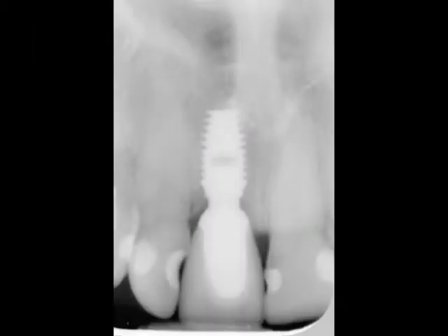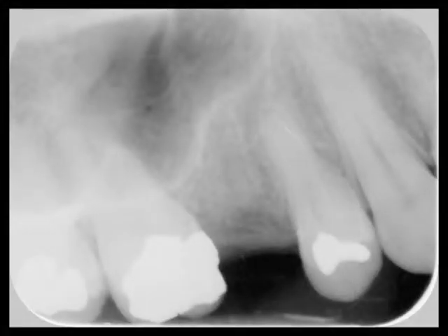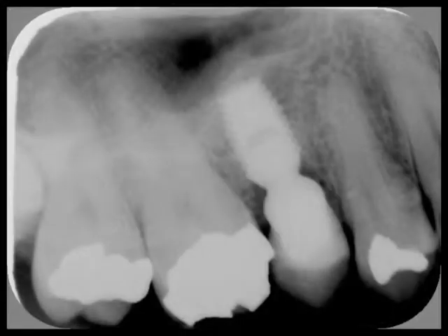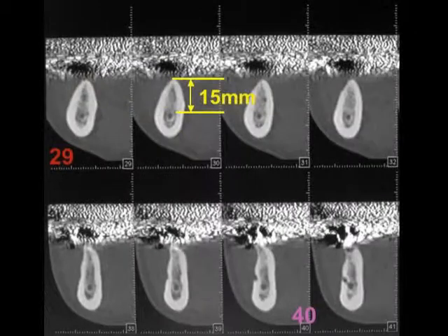However, since radiographs are not necessarily precise representations, their magnification and/or distortion must be considered while using them with an implant overlay to determine an appropriately sized implant. With digital radiography, only computer-generated and adjusted simulations should be used.